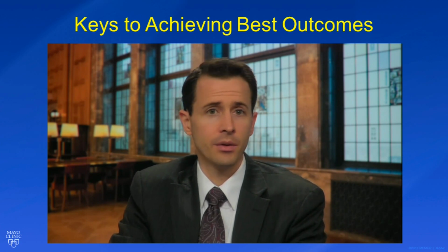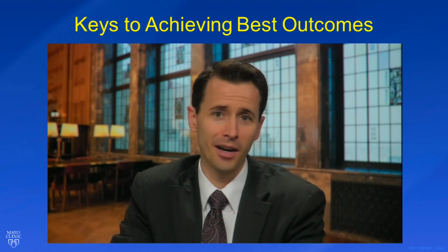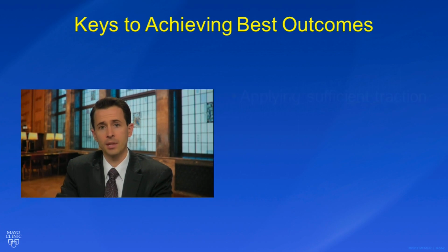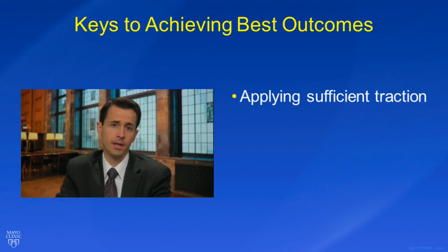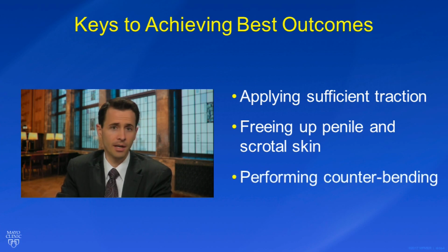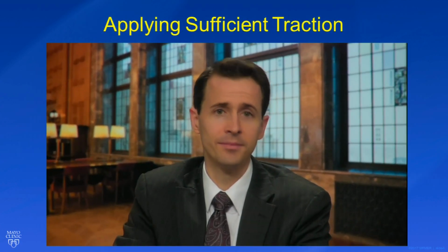Now, the goal of this video is to review some of these steps, and I'll review each of these one at a time so you can jump ahead to the area that's most applicable to you in your situation. The current video will discuss applying sufficient traction correctly, making sure that traction is occurring to the penis itself rather than the penile skin, and methods for applying counterbending forces to assure that traction is applied to the area of curvature. Now first, applying sufficient traction correctly.